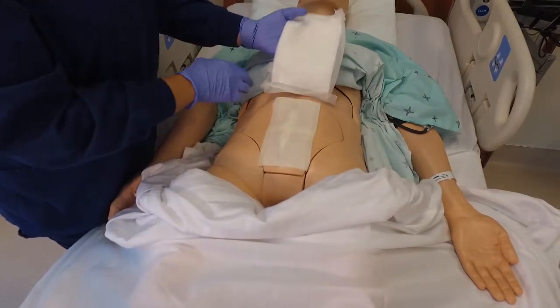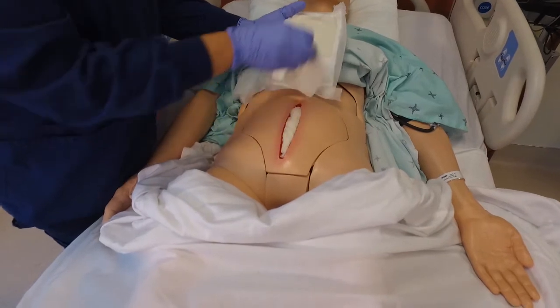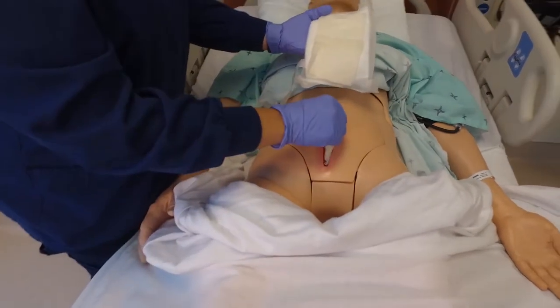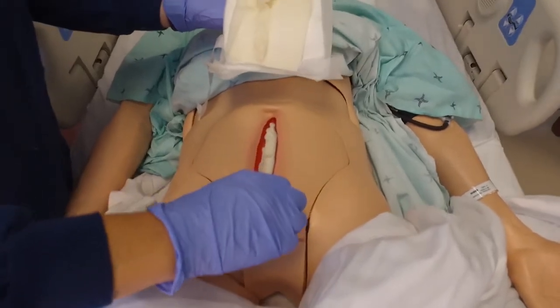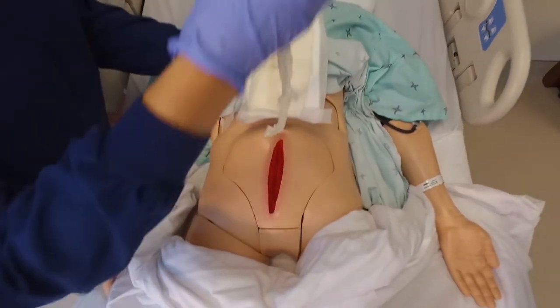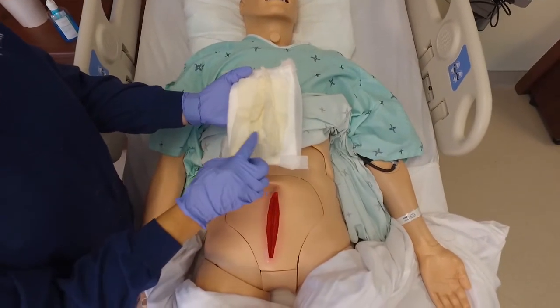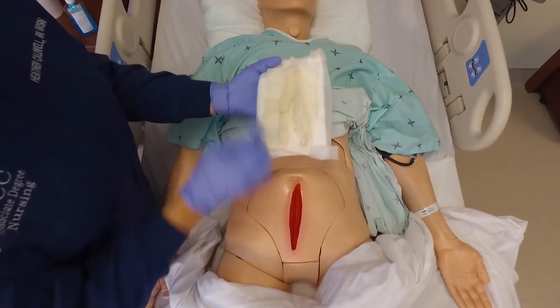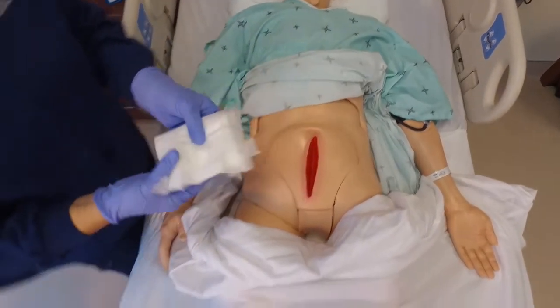The nurse removes each layer of dressing separately, assessing the color, odor, consistency, and amount of drainage using the acronym COCA. The nurse should also count the number of dressings removed to ensure that no dressings remain in the wound. The nurse then disposes of the soiled dressings.